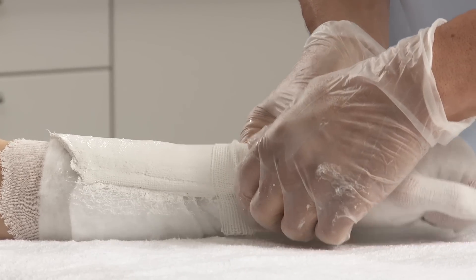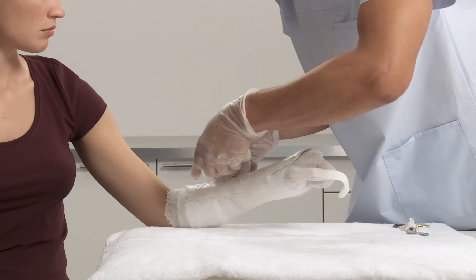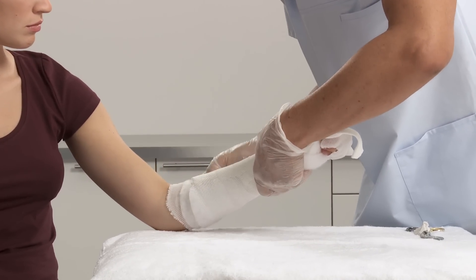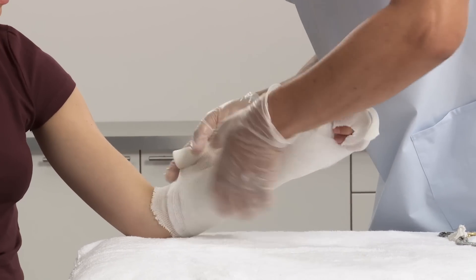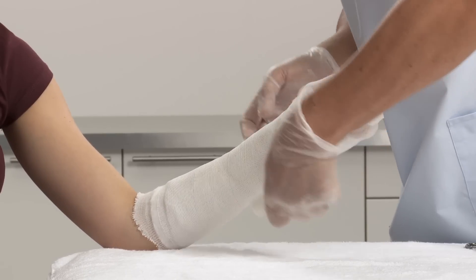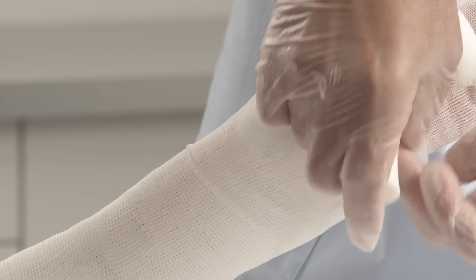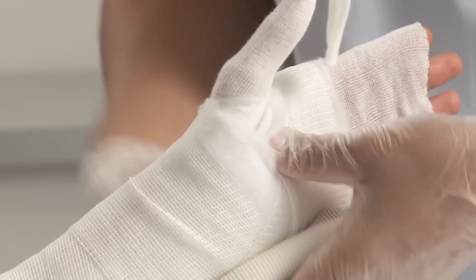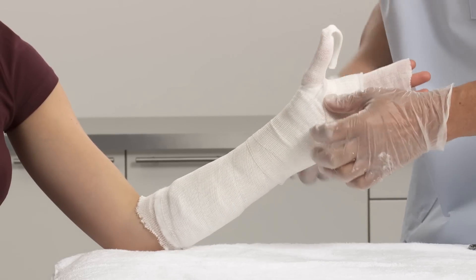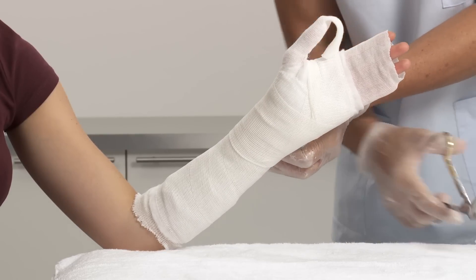To secure the splint, wrap with the bandage starting at the wrist, at first going proximally. Overlap the bandage by 50%. Continue wrapping, now going distally, going twice around the thumb and wrist. Cut the bandage and secure.